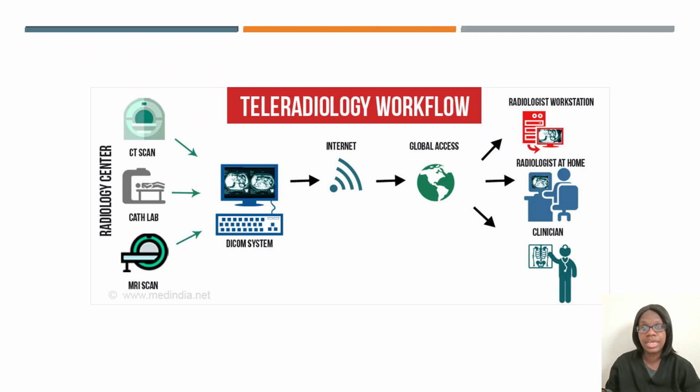So with teleradiology, it offers the ability for PACS to send images over a large or local area network, also that wide area network, from your imaging department to an off-site location such as the radiologist's home or maybe their hotel room if they're on vacation. They could be on a beach, who knows?